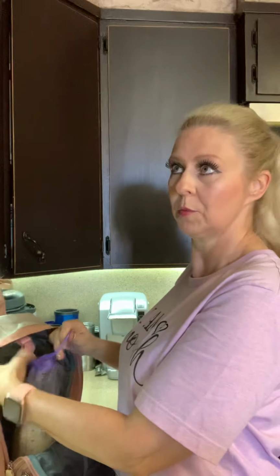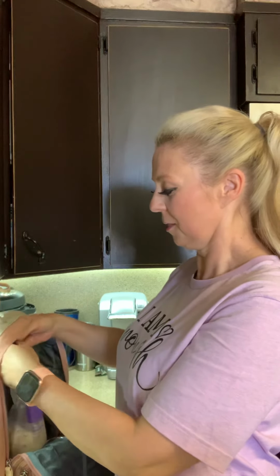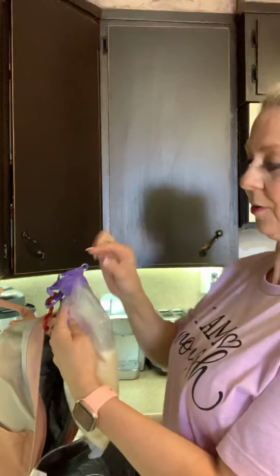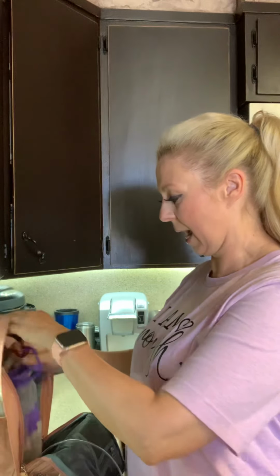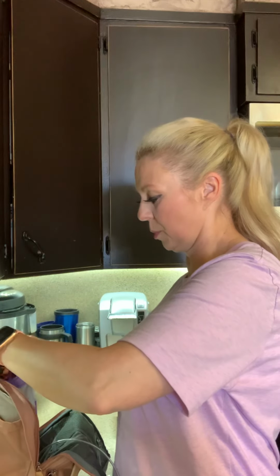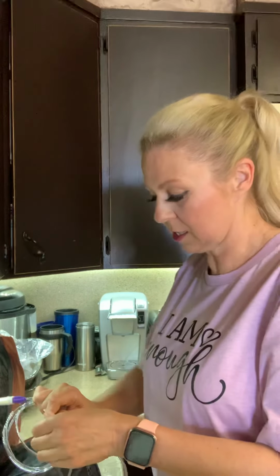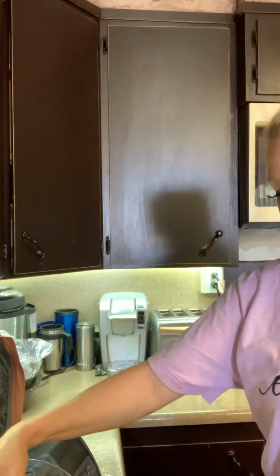And then I have this cute little backpack that's padded that I finally just bought after 3 months of having a feeding tube. The backpack I had didn't have padding, and the pump was just in this little thing on here. I don't know how you can see it very well, but right here and right here gouges in your back. And it has to be upright so that it can flow into the pump and into me, because if you don't, then it gives you air into your digestive tract, and when your digestive tract doesn't work, it does not feel very good in there.